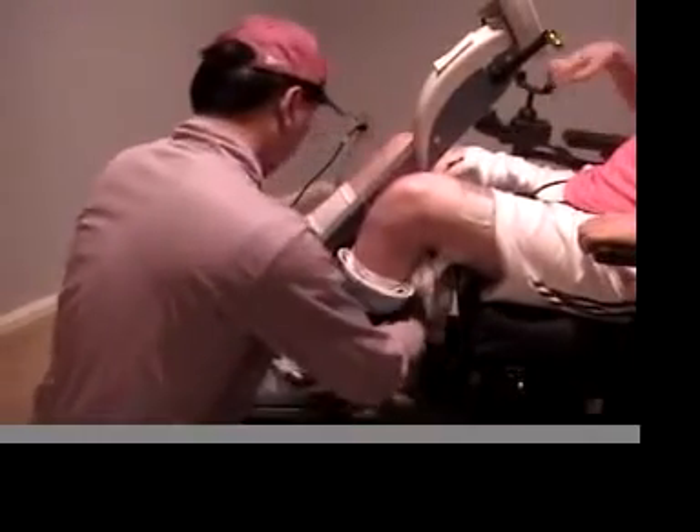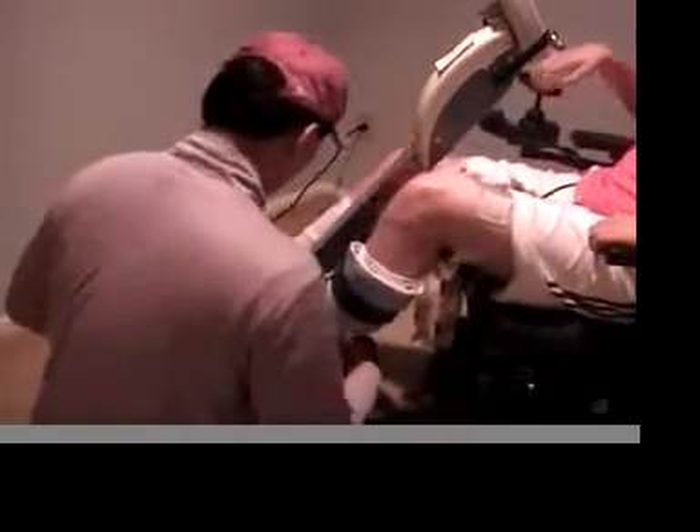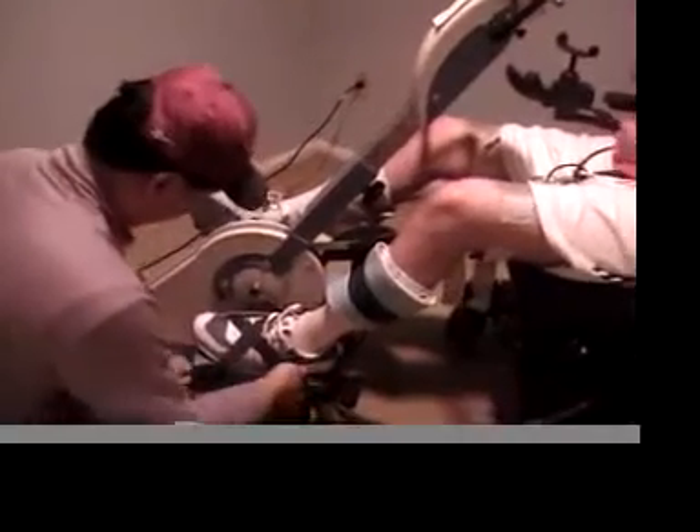Pretty much I take off the legs of my wheelchair and I wheel up to the bicycle. Then my caregiver will take my legs and strap them into the leg plates. If you do have a leg bag, you can just take off the strap and place it on the side so that it rests comfortably.